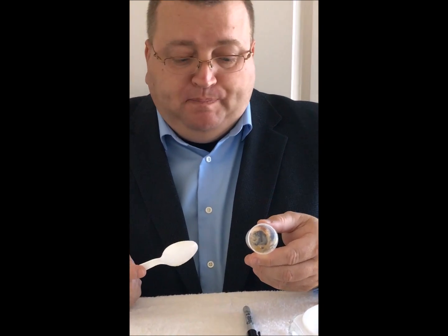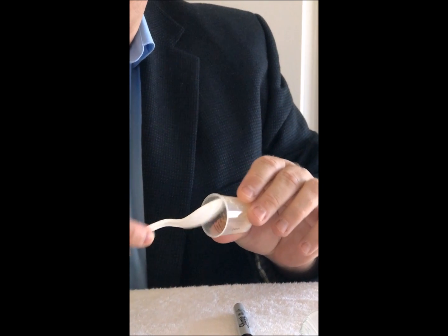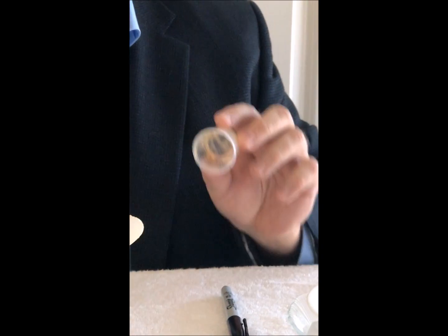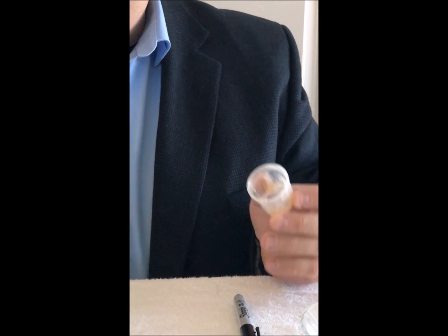they need. But as you'll notice, if you zoom in, no matter what kind of spoon you have, and there are different shapes and sizes, there's almost always going to be both medication and material still left in the cup, making you wonder how much of it actually is going to be getting to the patient. What kind of dose are they really maybe getting?